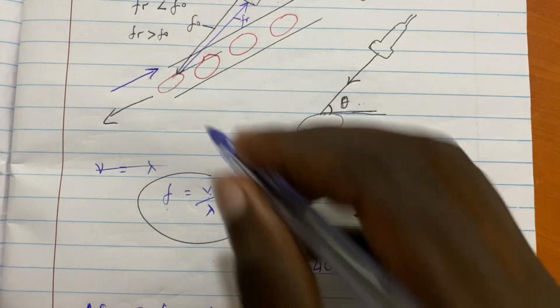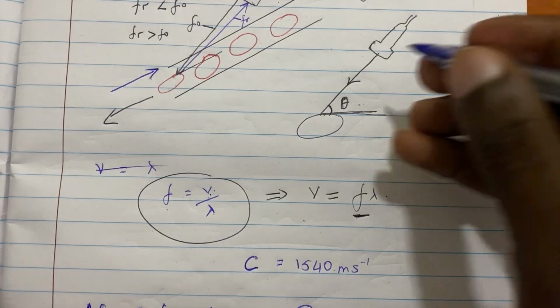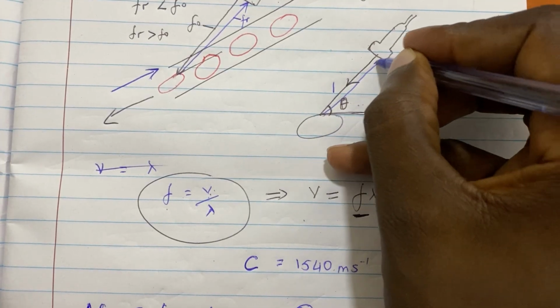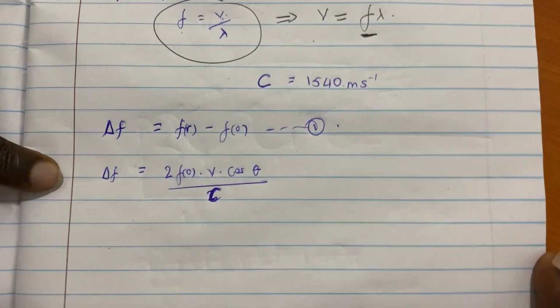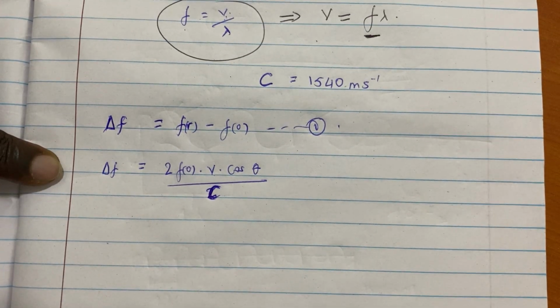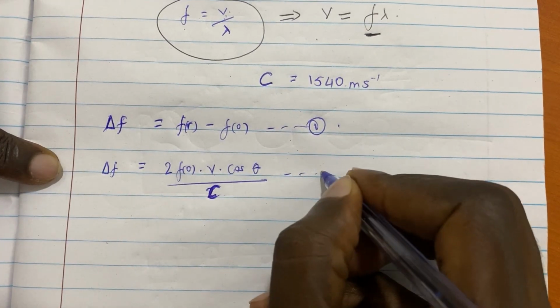And then this 2, remember I've been telling you that it is transmitted and then reflected. You will not listen to anything unless it comes back to you. So what is the distance it has moved? It has moved the distance 2 and 4. 1 plus 1 is 2. So these two journeys, the sound has to move. It goes, it comes back. It's like an echo. That's why we call it echocardiography. It is the one that is bringing this constant 2. Because it has to move, you must receive back. If you don't receive back, then that is attenuation.